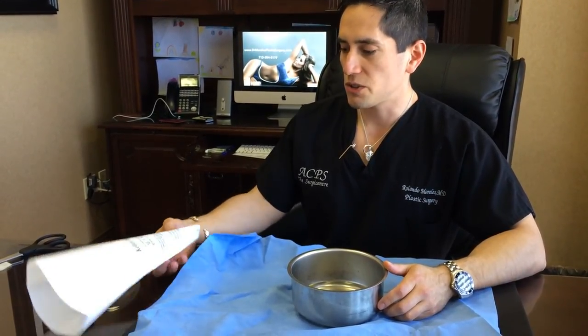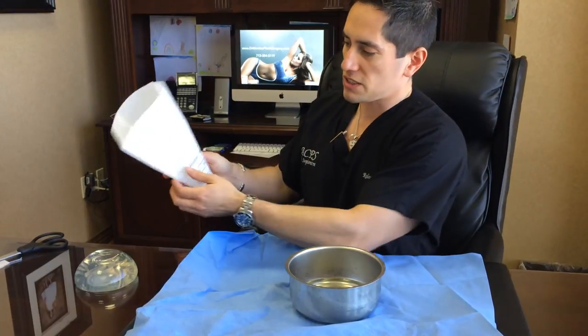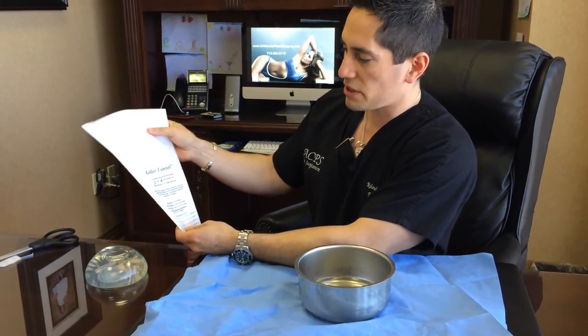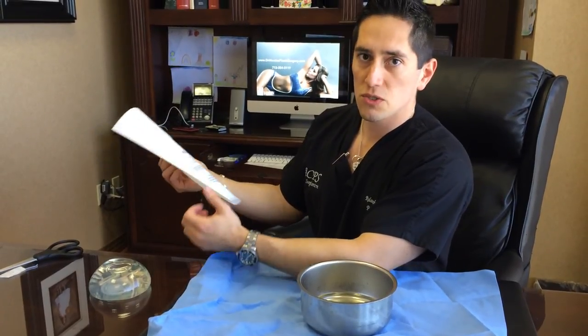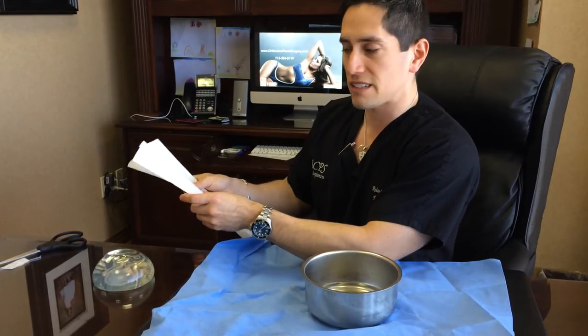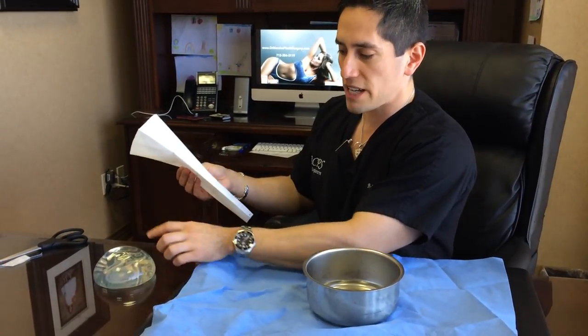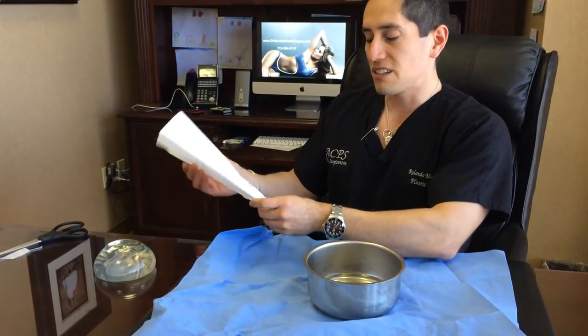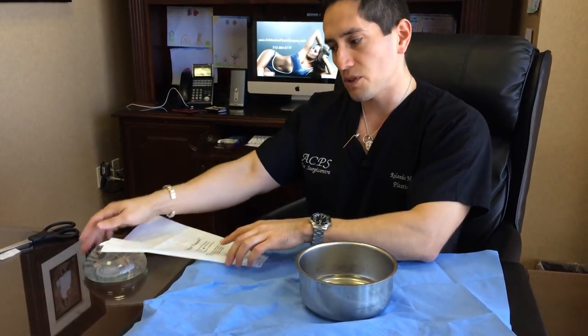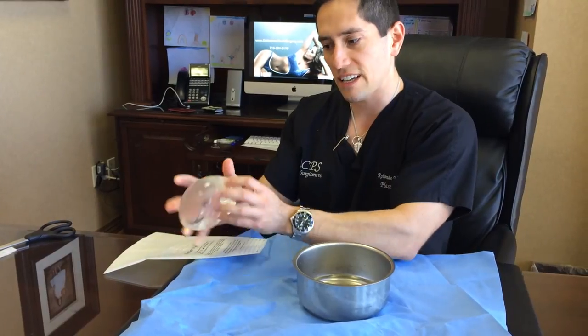I use a device called the Keller funnel, and this is what it looks like. It's designed strictly for silicone breast implants. The whole purpose is to streamline the process of implanting a silicone implant, making it safer and less traumatic to the implant itself. It's a lot easier on me than using an incision this big and pushing my fingers in to put the implant in. You push it in like that.